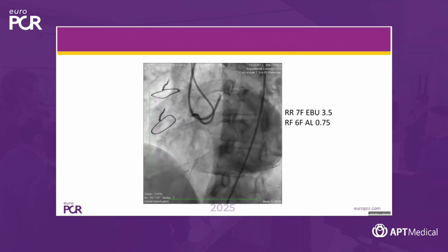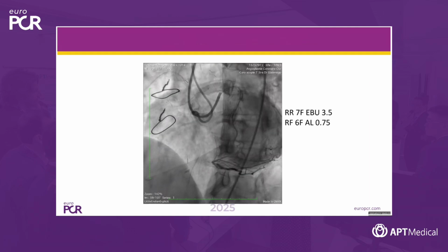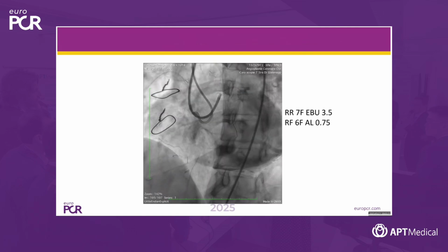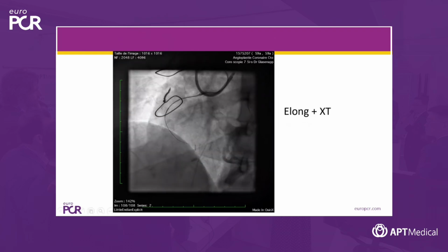the positive criteria for this approach was the channel we just saw on the dual injection, and we start with a smooth, soft wire, which is an XT wire, and with Elong microcatheter. And it was quite easy to progress until this part in the micro channel.